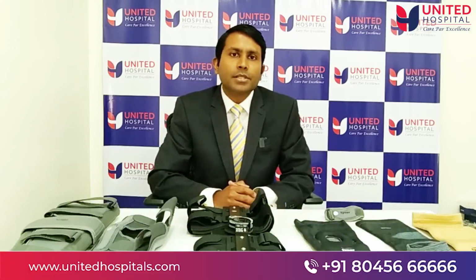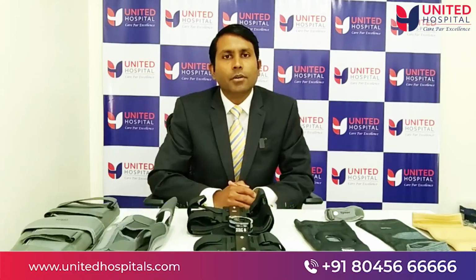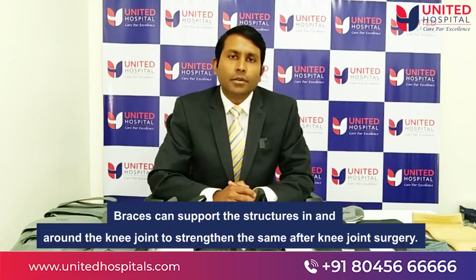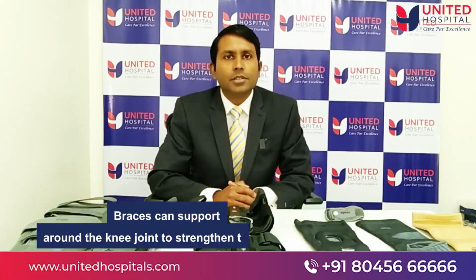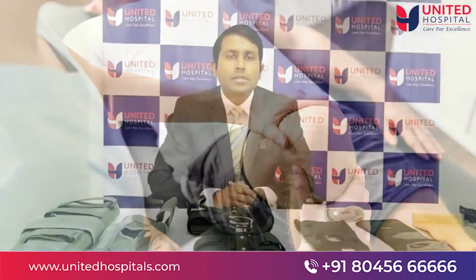So in general, splints are devices that are used for a relatively shorter period of time in patients who are recovering from either ligament or bony injury to the knee joint, or who recently had a surgery on their knee joint. In contrast, braces are devices that are designed to support the structures in and around the knee joint and are often combined with physiotherapy and rehabilitation exercises to strengthen the structures around the knee joint.